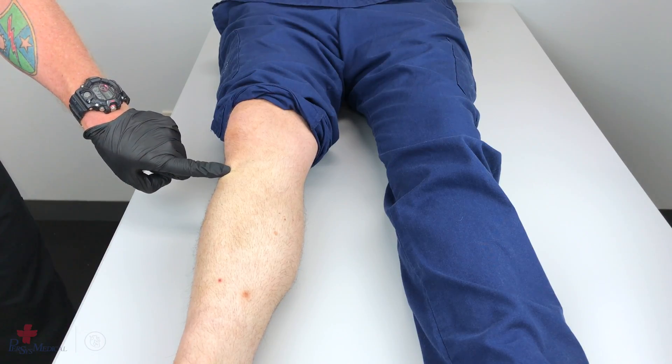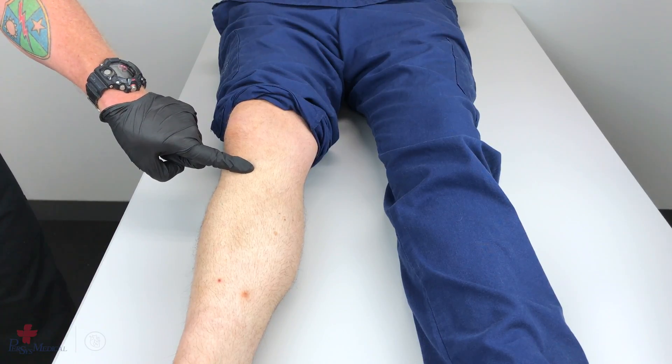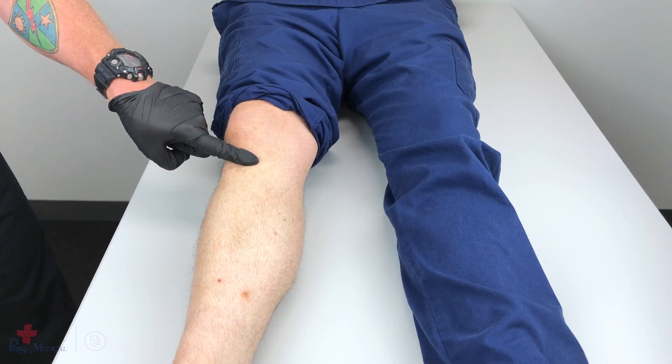Go approximately two centimeters medial to the tibial tuberosity, and approximately one centimeter superior. This is the proper insertion site for the tibia.